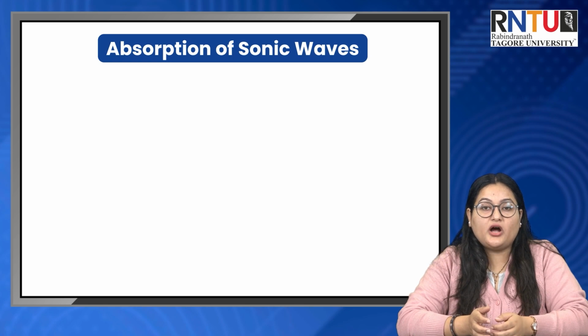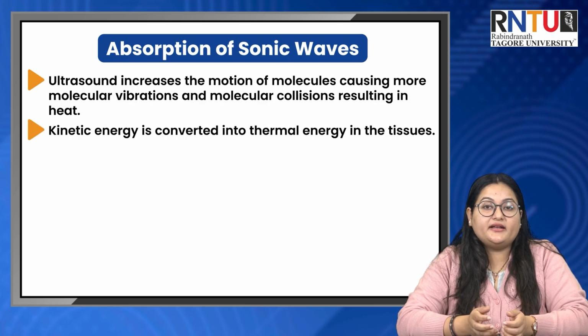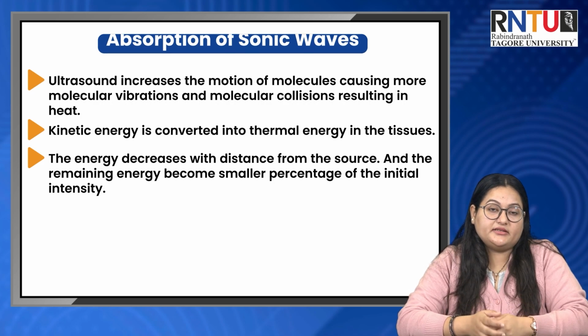Now we will discuss how sonic waves are absorbed. Ultrasound will increase the motion of molecules, causing more molecular vibrations and molecular collisions, resulting in heat, and kinetic energy is converted into thermal energy. As it passes through the tissues, the energy will decrease with distance from the source, so that the remaining energy will become smaller and smaller in percentage of the initial intensity.